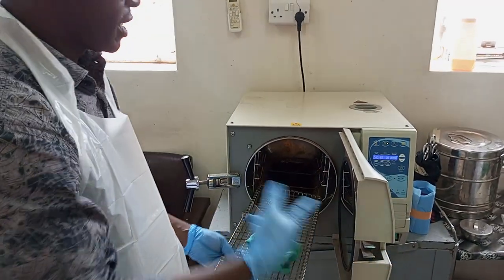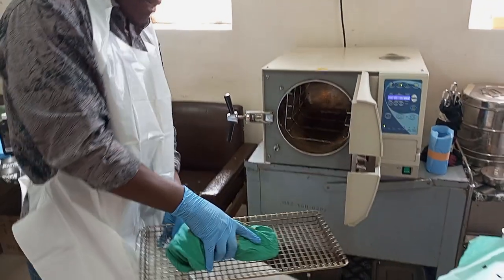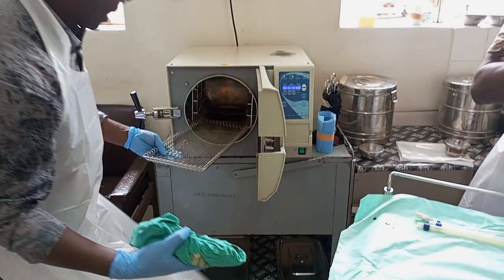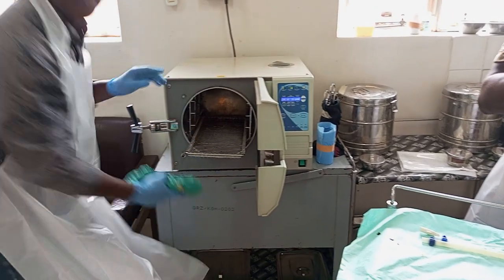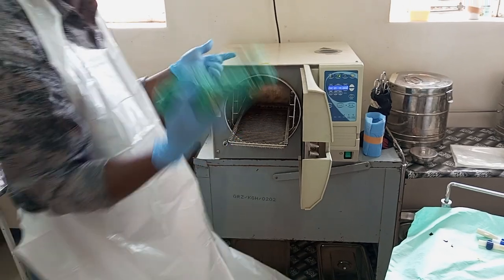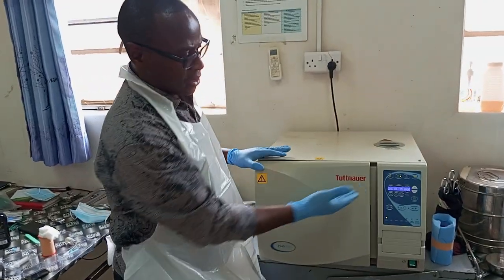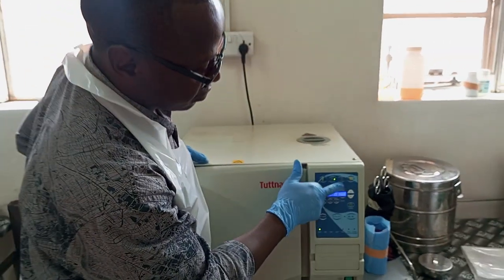No need to get a sheet for separate collection. These instruments are inside and they are wrapped. So you can simply collect them and put them on the shelf in readiness for another person to come and use them. These are ready for use on the next patient. They have been sterilized.